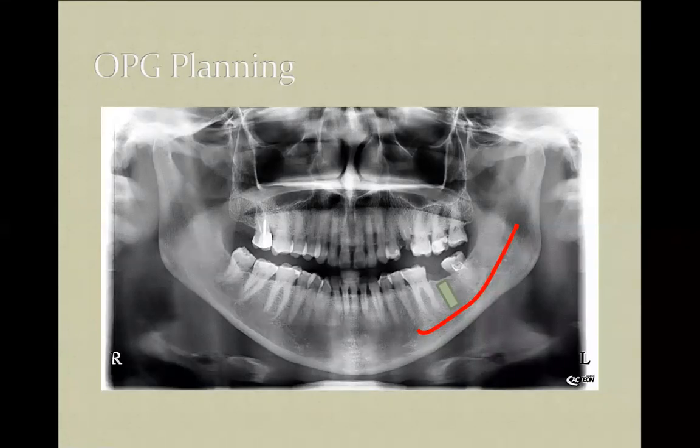But let us talk about ordinary concepts, yet it is actual. You have to trace your anatomy. You have to understand where it is, what it is, and on the lower jaw it is the inferior alveolar nerve. And in simple cases, there is nothing to do with this nerve.